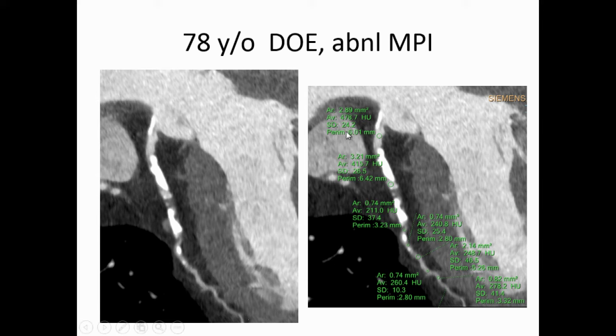If you look at the coronary lumen attenuation distally, you can see what we call the transluminal gradient is kind of reversed, meaning that the distal part of the vessel is higher than or similar to the more proximal part of the vessel. The segment downstream from the occlusion is opacified. So you may think this vessel is being filled by collaterals, okay? Blood flow is coming this way.